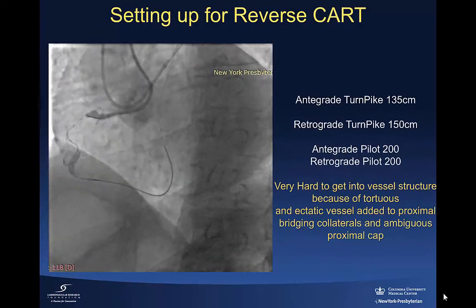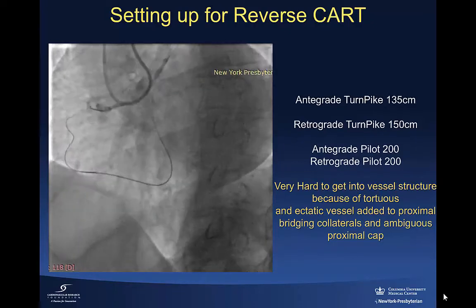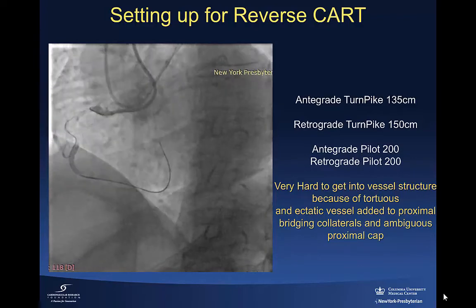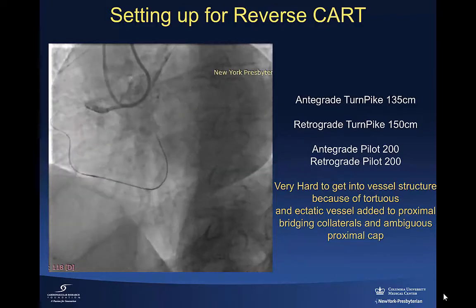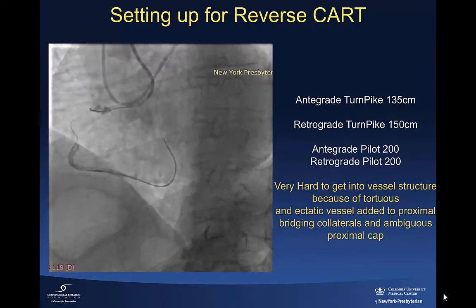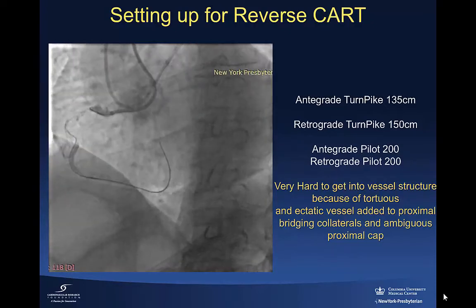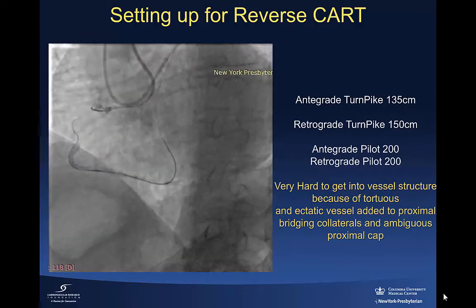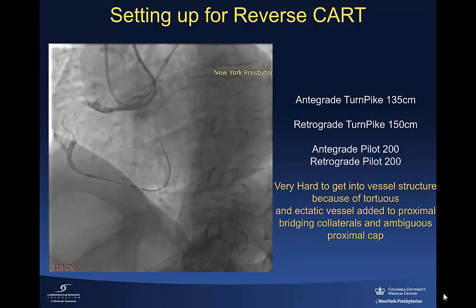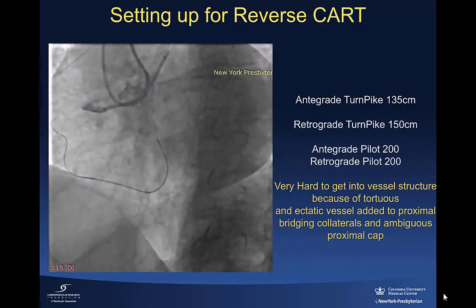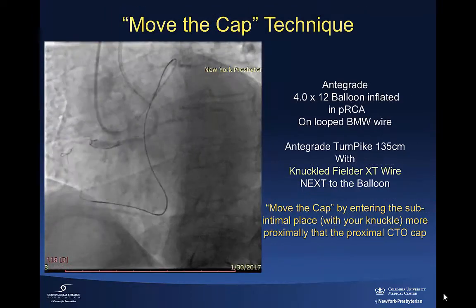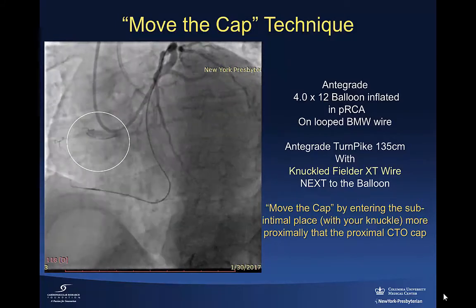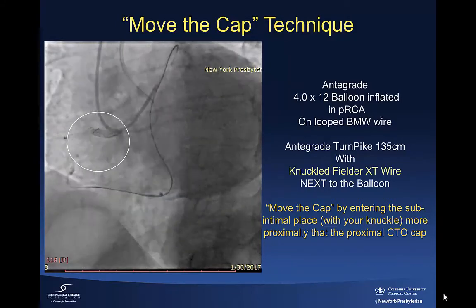Then it was very easy to advance the microcatheter close to the distal cap, but despite my efforts, I was not able to create a dissection, and I was not happy with where the wires were going. My stiff wires — my Confianzas and my Gaia 3s — were going into places that I was not happy with. So I had to make a decision at this point either to abort the case or figure out an alternative approach. What I decided to do is convert from retrograde to antegrade, and given the ambiguous proximal cap, I utilized what we call the move the cap technique. This is a very safe way — I think it's the safest way to clear proximal cap ambiguity.